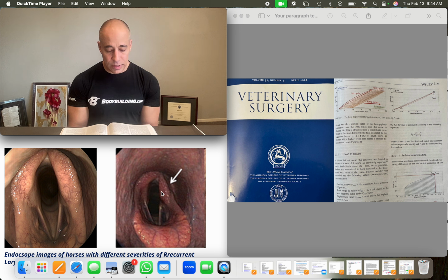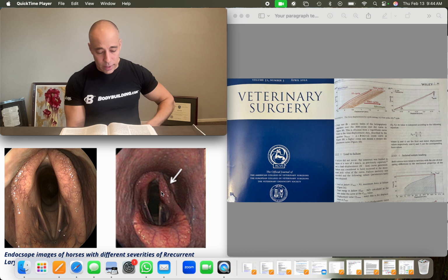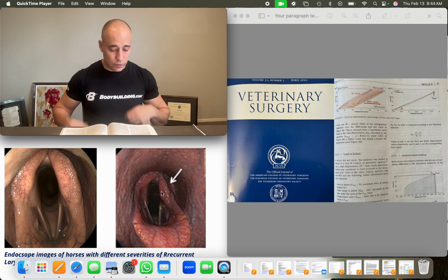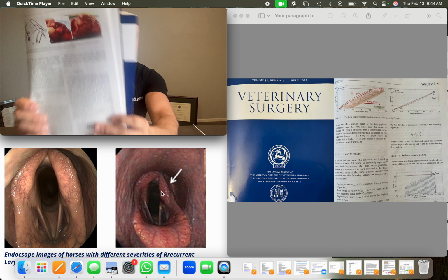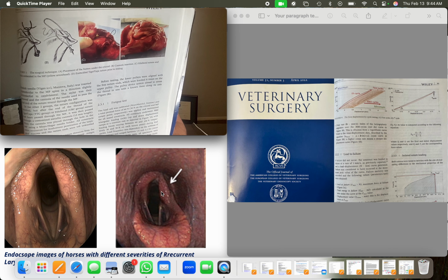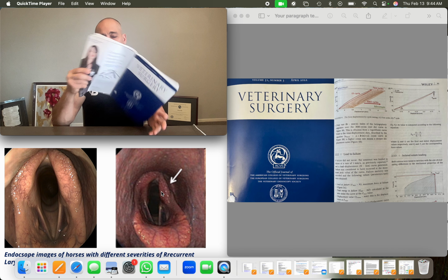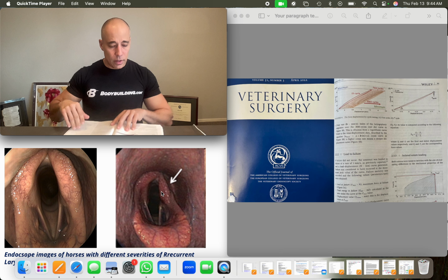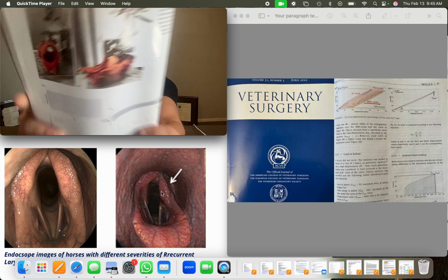For these specimens, the extrinsic musculature and the cricoarytenoideus lateralis were removed. For the surgical technique regarding the cadavers, they did a left-sided laryngoplasty, and usually we do left-sided because most surgeons are right-sided. But obviously you're going to do the side that the horse is paralyzed on, and left happens to be also the more common, but they can be paralyzed on both sides. This is the machine that they use to do the testing on the larynx cadavers.